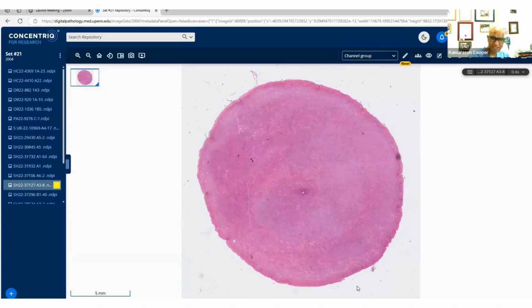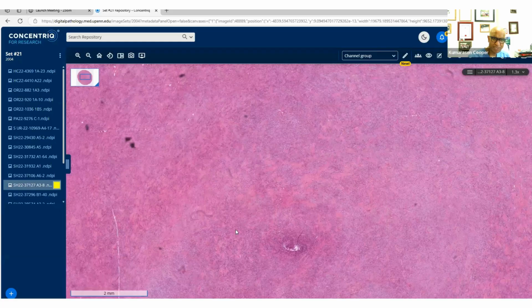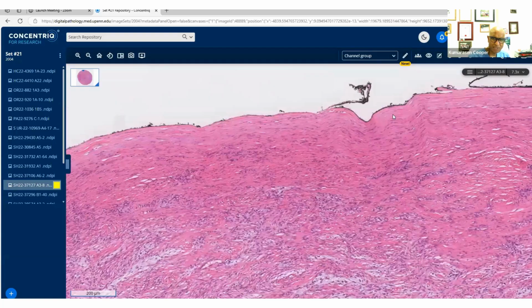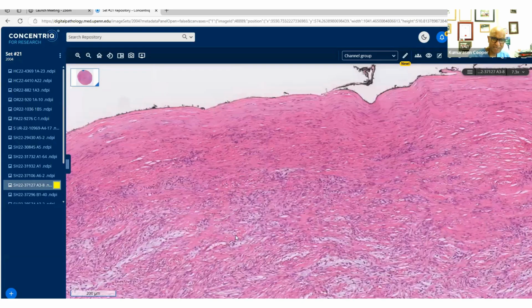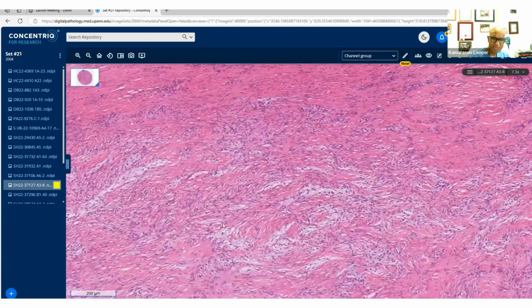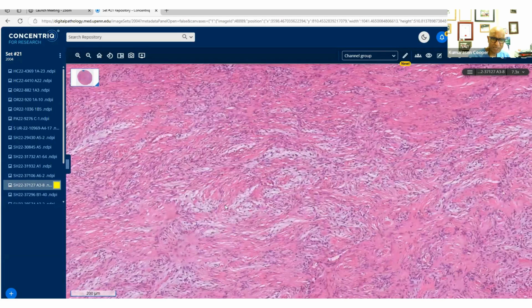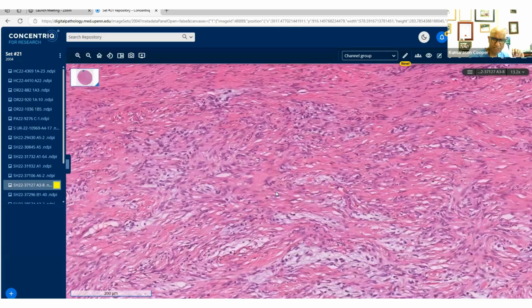As you can see here, this is a section which shows a very well circumscribed tumor. We can start at the top, and just to demonstrate the nice circumscription, we ink all of our tissues. So that's the black ink. And again, you can see these spindle cells, which come in two sort of patterns: short fascicles with myxoid areas, and then more sclerotic spindle cells here.